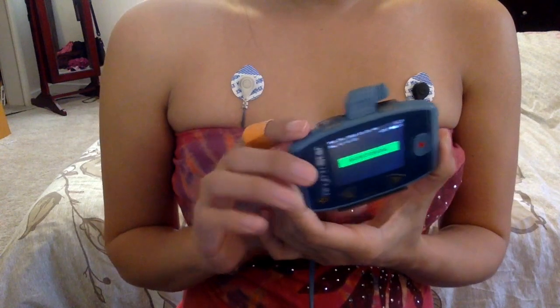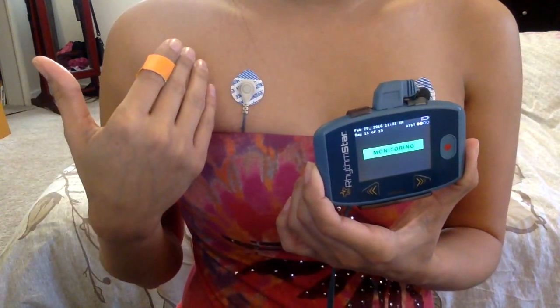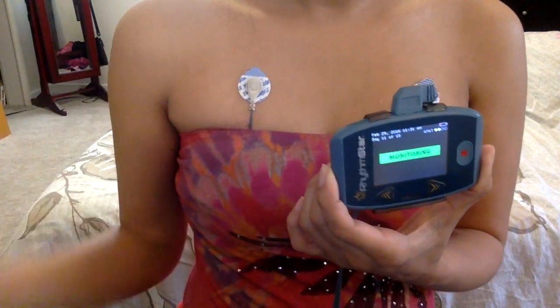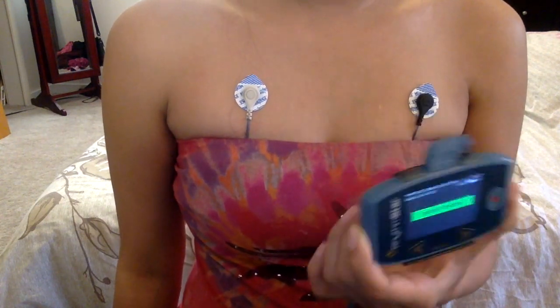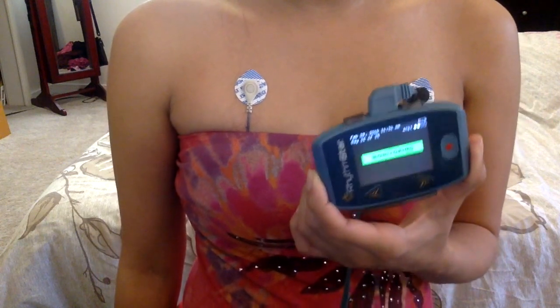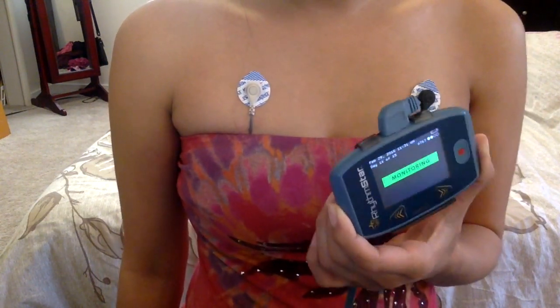But hopefully I could have this on for 2 weeks. I've been having some weird chest issues, pain, breathing. So I went to a cardiologist. They did notice some irregular heart rhythm. And it doesn't happen every day. So I have to wear this for 2 weeks to see if they could find what's going on.